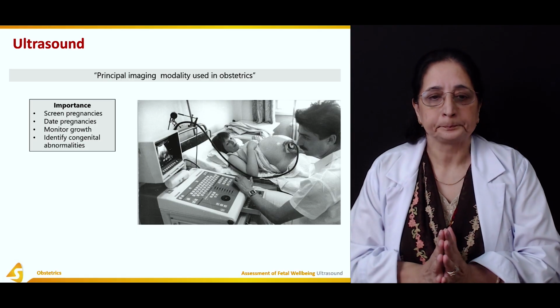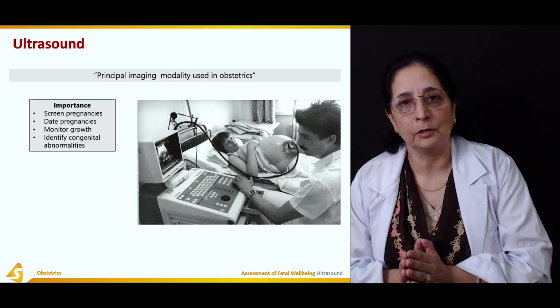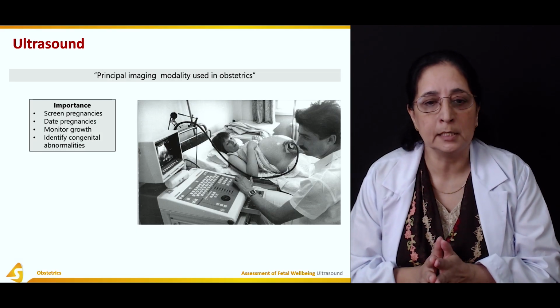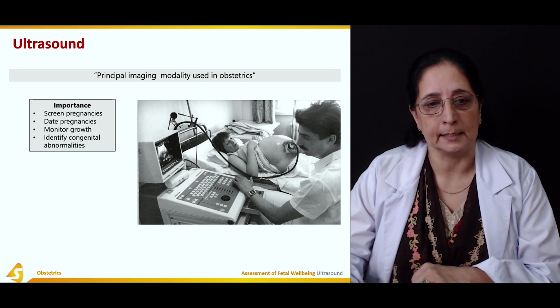So a lot of functions are performed by ultrasound in obstetrics: dating pregnancy, monitoring growth, identifying congenital abnormalities.